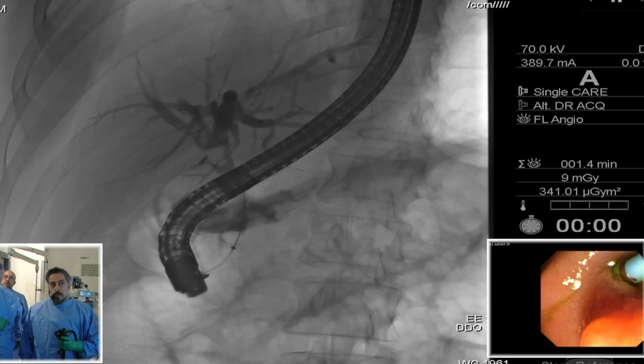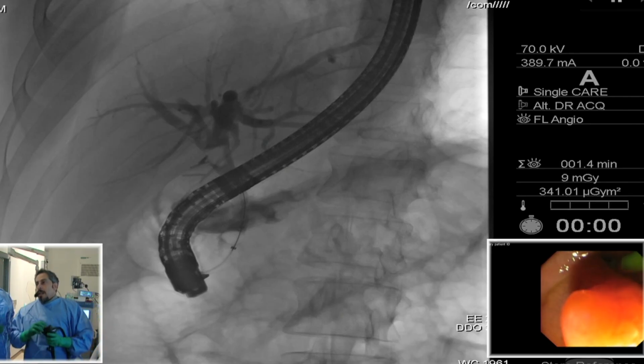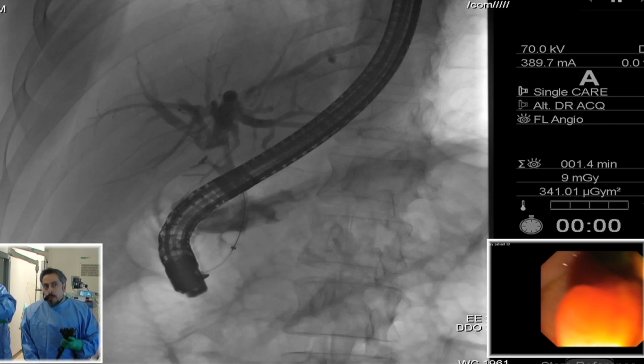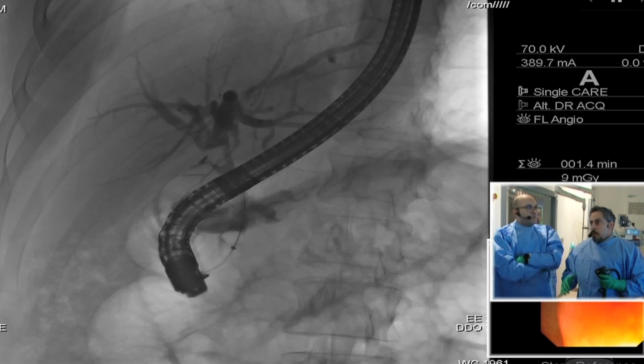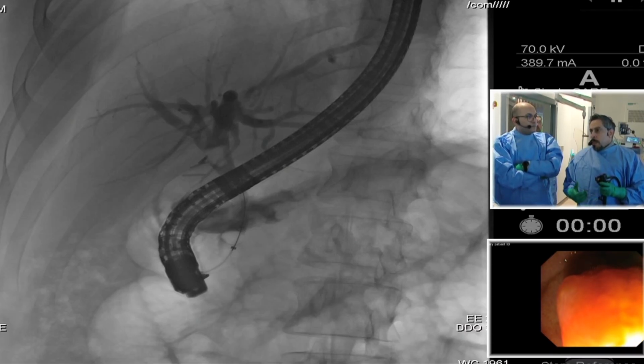So the discussion now between me and Dr. Mohammed and also for the floor is which is the best management for this patient, EHL again or laser lithotripsy. What do you think, Dr. Mohammed? Honestly, I have more experience with laser lithotripsy. I do prefer laser lithotripsy over EHL. Most of the time, the EHL probe actually gets malfunctioned during the procedure. And I see laser lithotripsy is more effective in fragmenting the stones. Although the literature shows there is no significant difference between the two, however, you can see more fragmentation with laser lithotripsy.